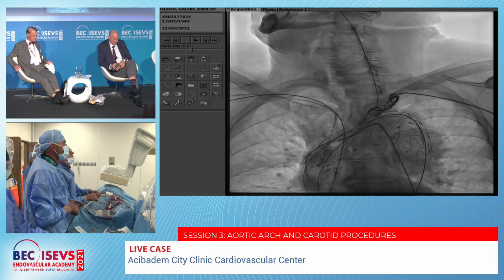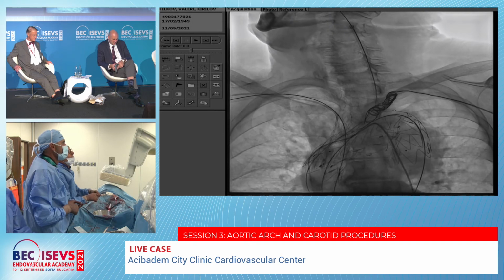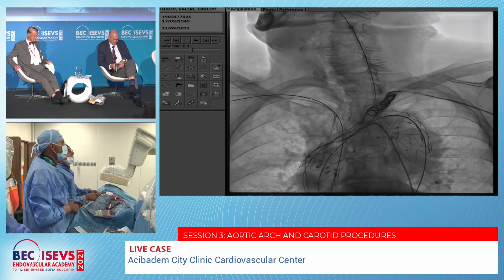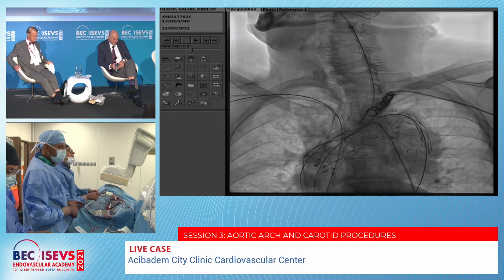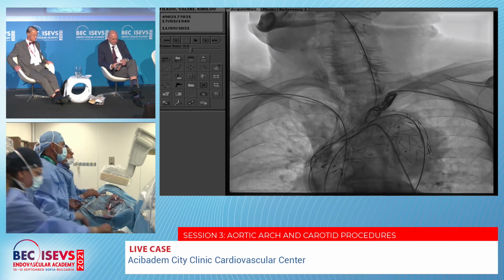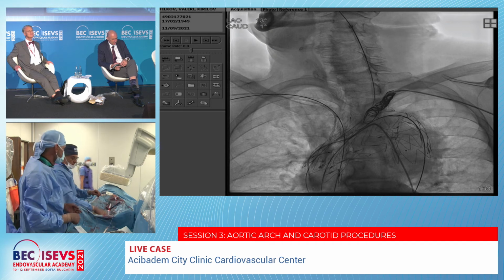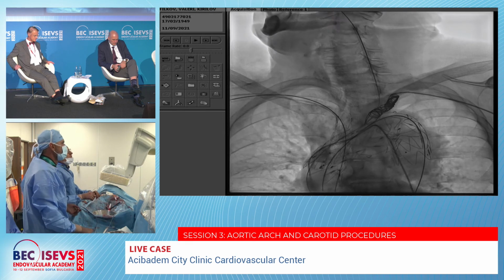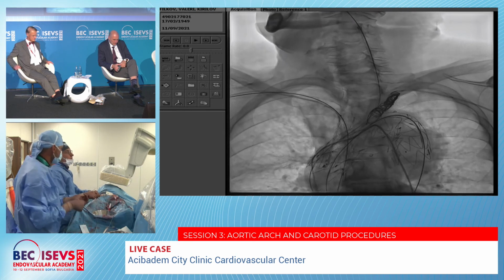Eva, do you foresee any problem removing the pigtails which are pinched along the graft in the brachial artery? Do you foresee some problems taking out the pigtail which is pinched in the truncus? No. In fact, we almost never had such problem.